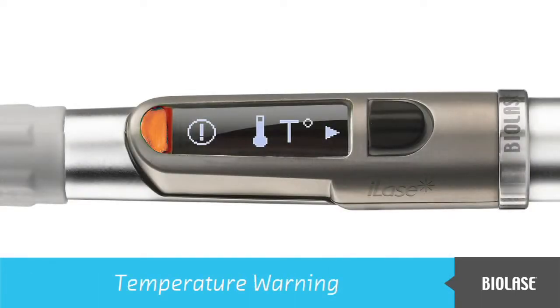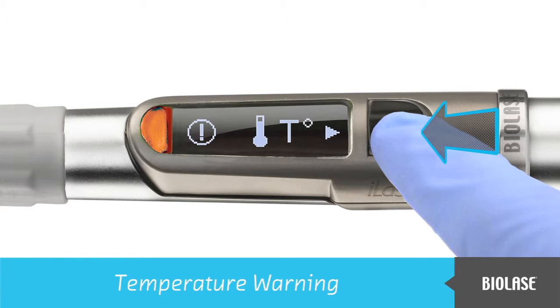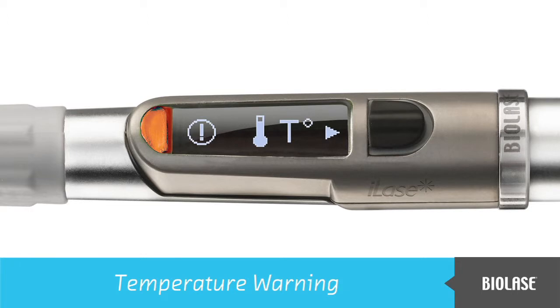If the internal laser temperature starts to get hotter, you will see these temperature warning symbols in the interface display. Pressing in the black navigation button will clear the error and return the iLase back to normal operation. However, it is advisable to stop using the iLase and allow the iLase to cool down for a few minutes before using it again. Even as the internal laser temperature rises, the handpiece should not be too hot for human touch. If the laser overheats, it will stop operation, and you will see these symbols in the interface display. Allow the iLase to cool down before using it again. Even if the laser overheats, the handpiece should not be too hot for human touch.